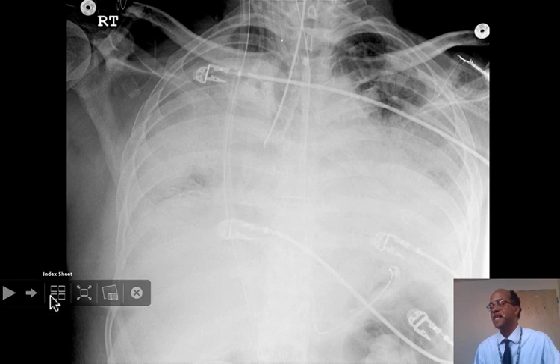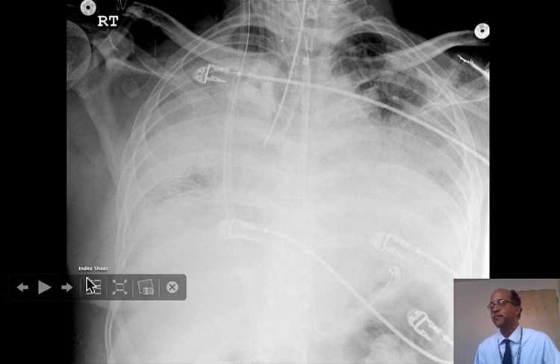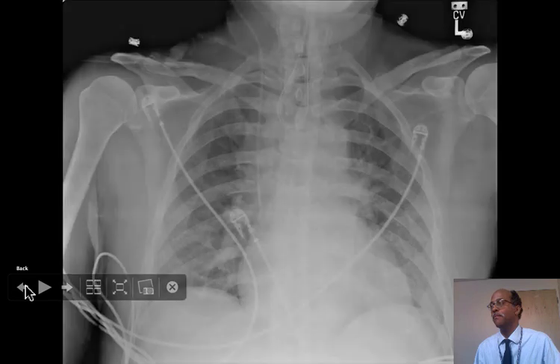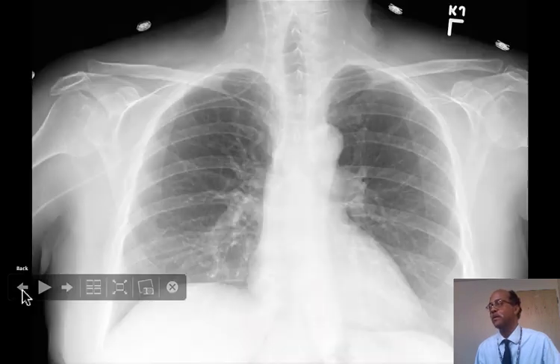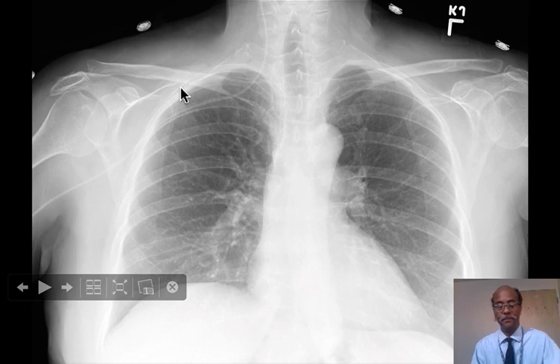So I've shared with you three cases of misplaced tubes: a right main stem intubation, a coiled nasogastric tube, and a misdirected catheter going up into the internal jugular vein.